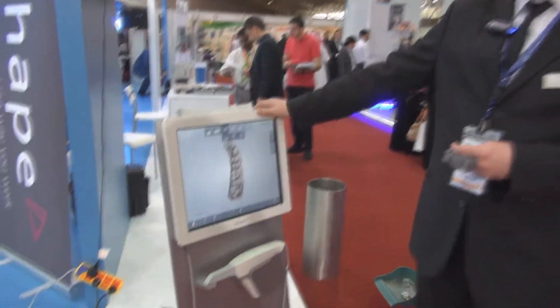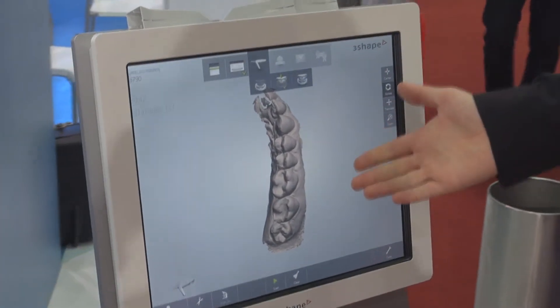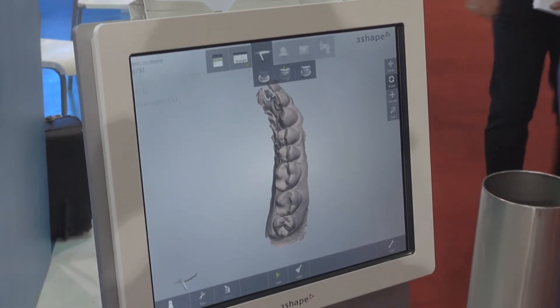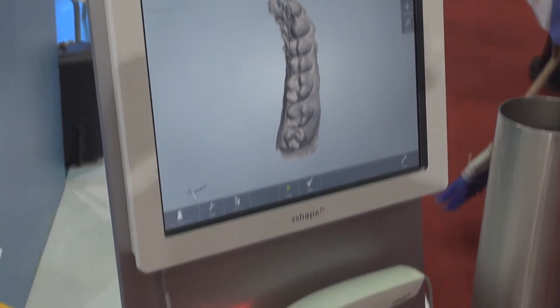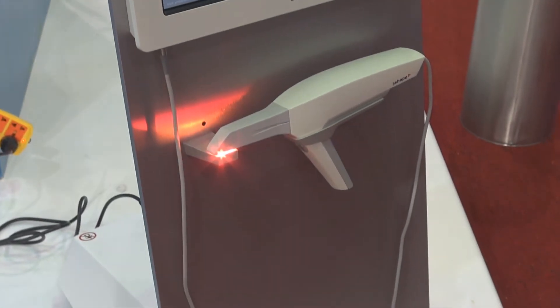We have first our dentist scanner — it's an intraoral scanner for making digital impressions. So the traditional way of making impressions can be changed to do it digitally the whole way through. We also have a solution for dental technicians and a lab scanner.